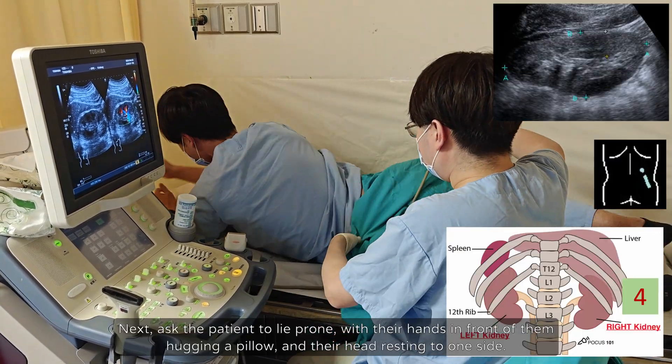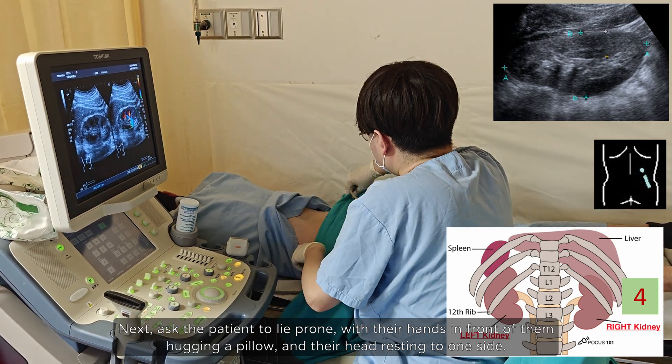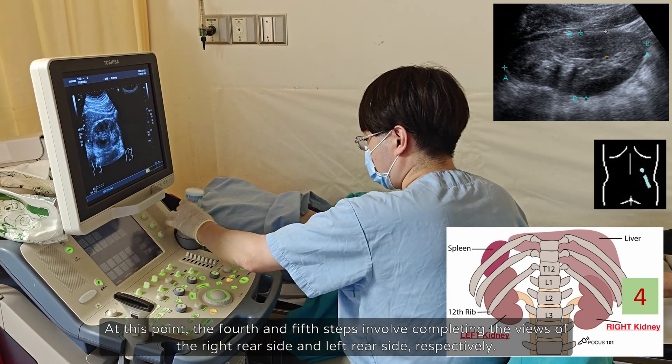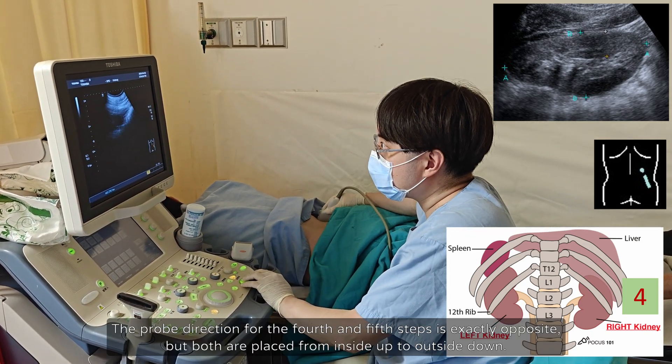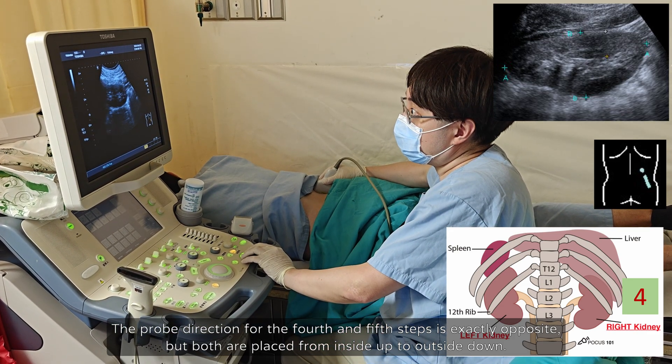Next, ask the patient to lie prone, with their hands in front of them hugging a pillow, and their head resting to one side. At this point, the fourth and fifth steps involve completing the views of the right rear side and left rear side, respectively. The probe direction for the fourth and fifth steps is exactly opposite, but both are placed from inside up to outside down.